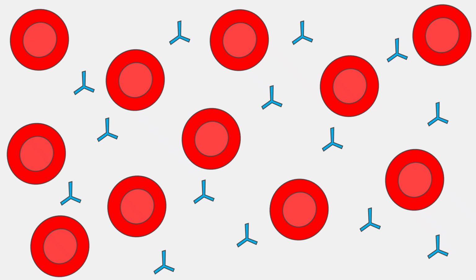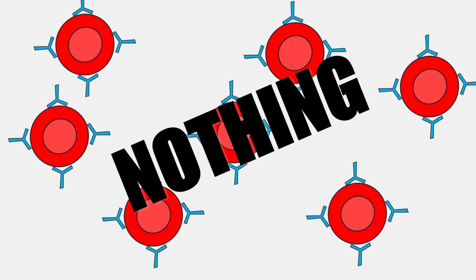Now let's look at what happens when we add IgG to a red cell suspension with the antigen present. When we spin it down, we end up with IgG-coated red cells, but the monomeric IgG can't bind another red cell, and so visually, you end up with nothing, or no agglutination. And this is a problem because if you actually have IgG-coated red cells in your tube, those cells are eventually going to be hemolyzed by the patient.